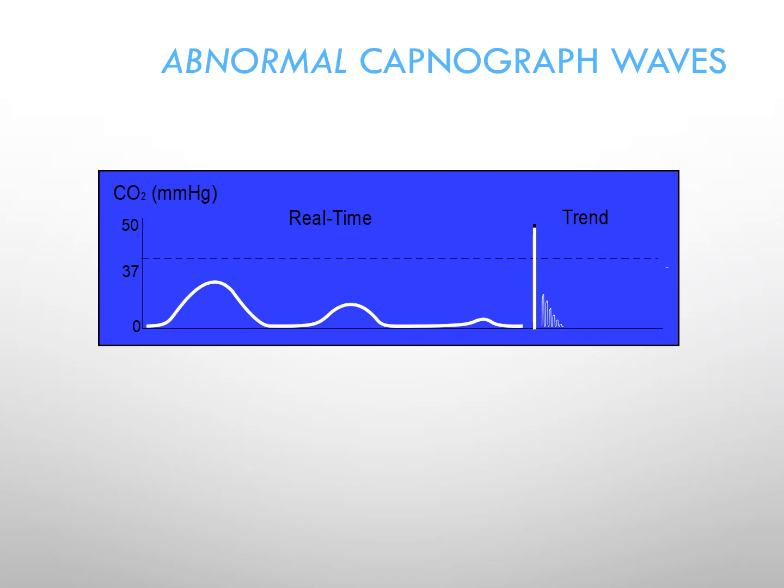The first few breaths had some end tidal CO2 because there was CO2 buildup in the hypopharynx, the area around the glottis, but not definitively in the trachea, because we don't see good formation of a rise and a plateau, and we don't see repetition of this waveform.